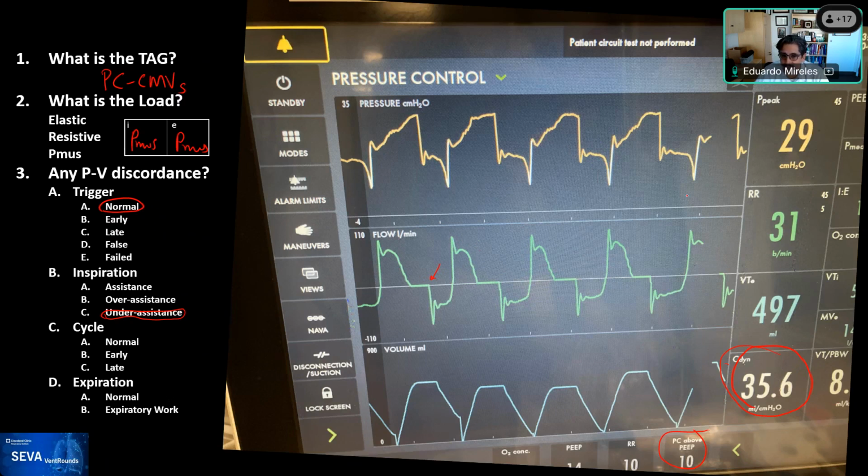But in this case, we're talking about PMUS, the amount of work that the patient is doing. It seems the patient is doing a high amount of work, but is getting some level of assistance, some level of support. I don't know of a good measurement right now that would help us, except probably doing P0.1 and comparing that to where we are, and seeing if the patient is generating too much pressure. Other than that, from the waveforms, there is some assistance happening. Rob, thought process on this?